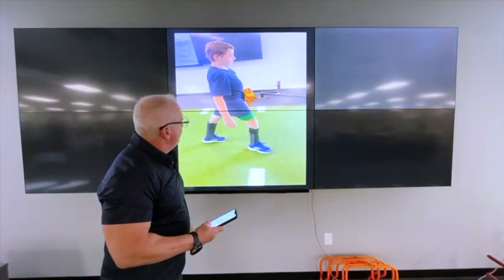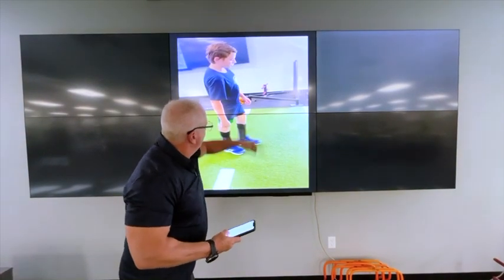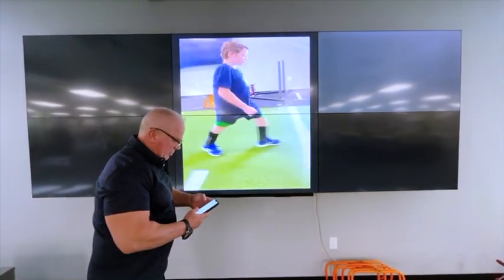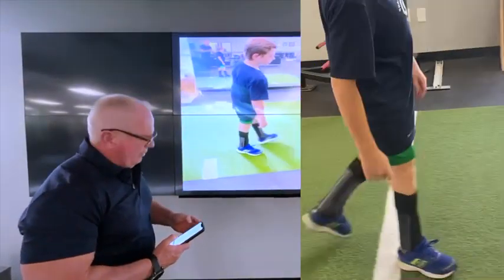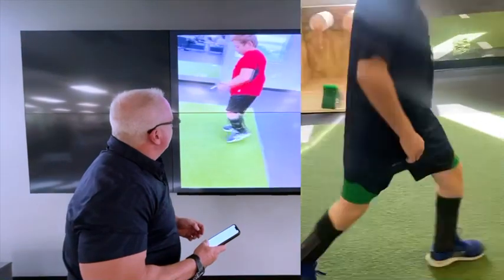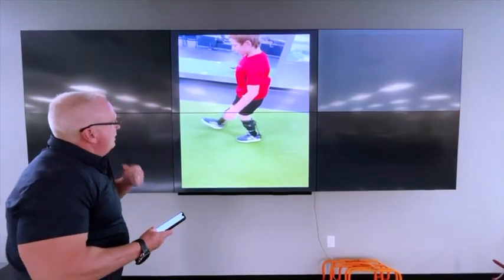So you can kind of see the step, the knee goes back into extension, and then he throws his hip around to get through and continue to walk. And this is how he's walked for several years. Now, if we take a look, this is the first day in the exoskeleton, actually the XOS.